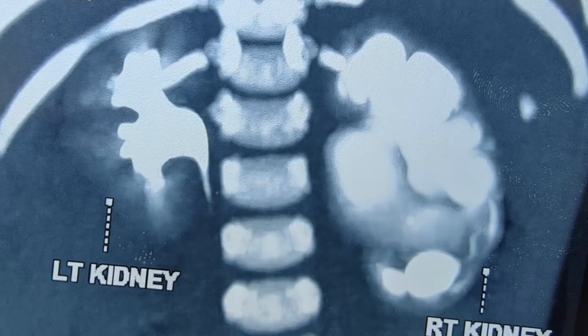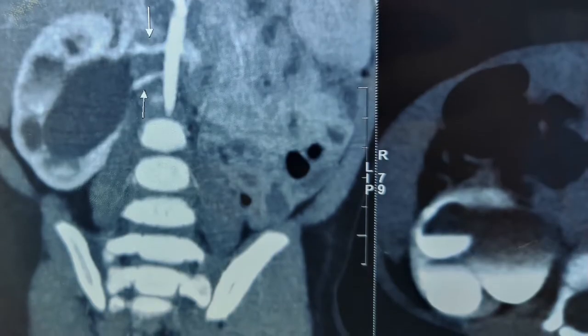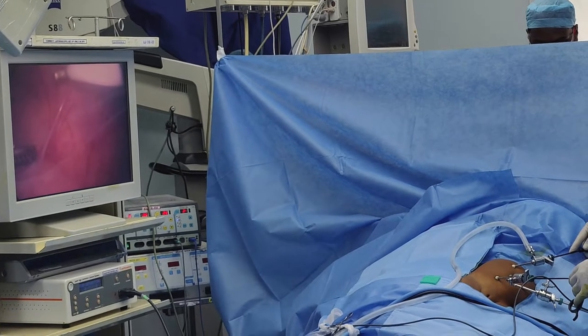As the CT urogram revealed — this is the posterior view — there is right kidney hold-up. There is a lower polar vessel and also the right renal pelvis is posteriorly malrotated.